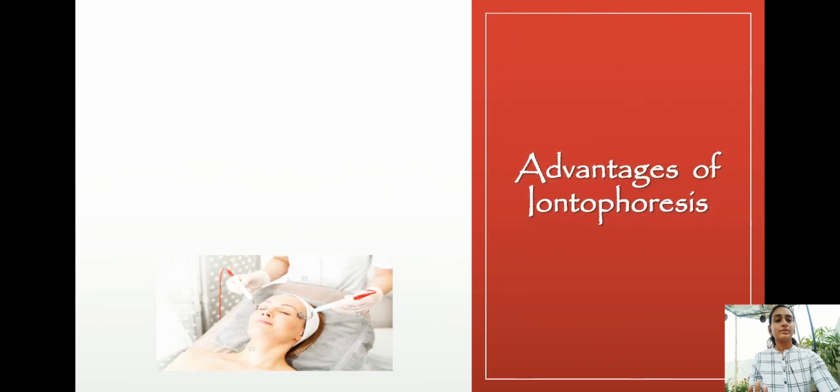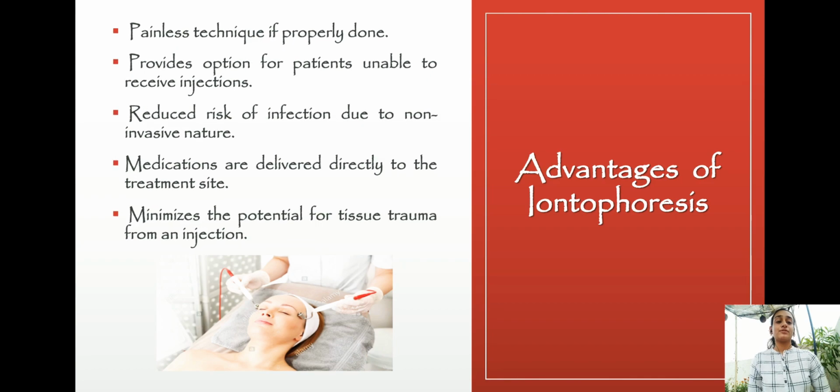Now, let's talk about the advantages of iontophoresis. This is a painless technique if properly done, and it provides an option for patients unable to receive injections, and reduced risk of infection due to the non-invasive nature, so you need not worry about any sort of infections at all. Medications are delivered directly to the treatment site, so it is proved to be one of the best treatments across the globe, and it minimizes the potential for tissue trauma from an injection, so you need not worry about the post-vaccination pain because there are no vaccinations used here.